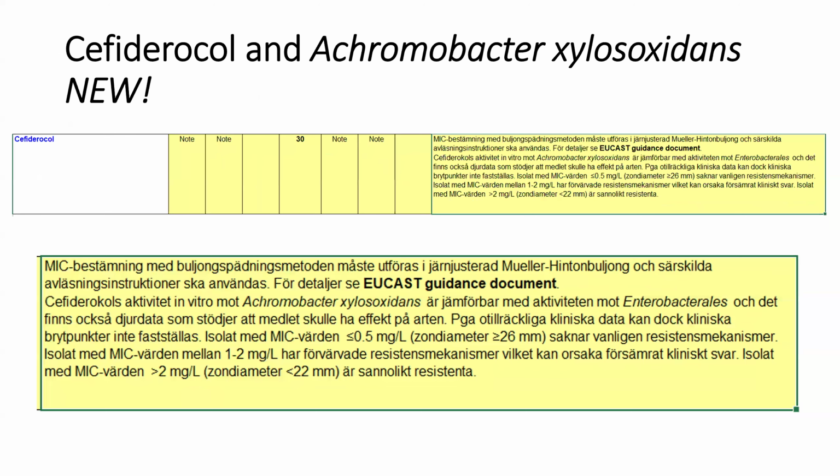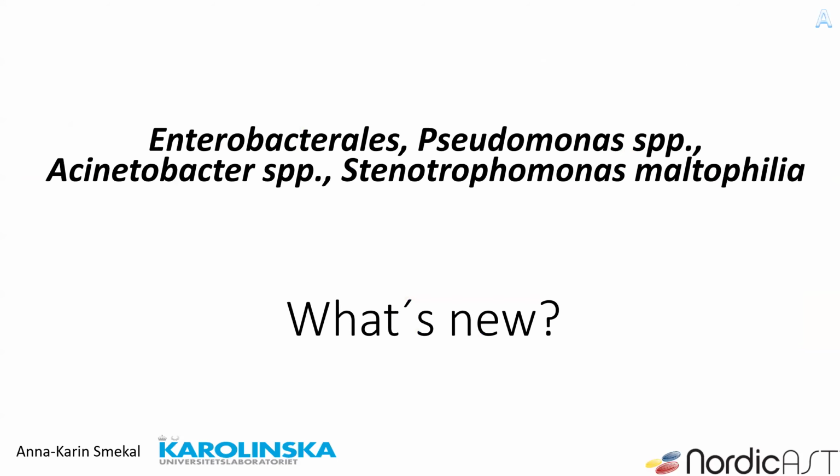And then we have a new slide with cefiderocol and a new comment also for Achromobacter xylosoxidans, which I think could be very, very useful in infections in patients with cystic fibrosis. So it goes the same way as the other cefiderocol comments, but the cutoffs are, of course, species specific. Yeah, we can go on.